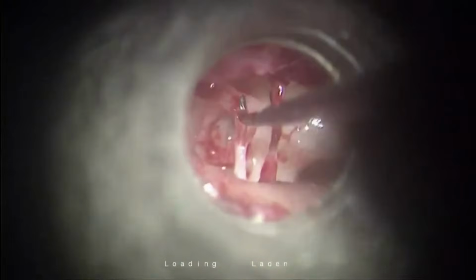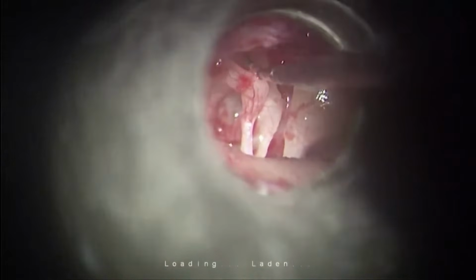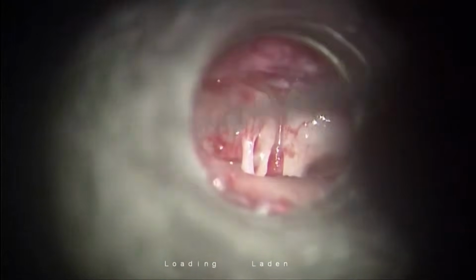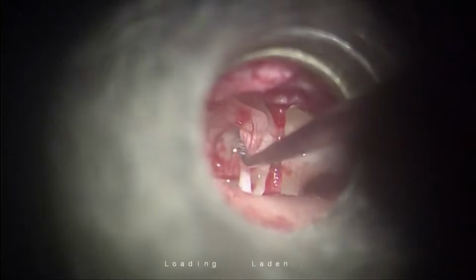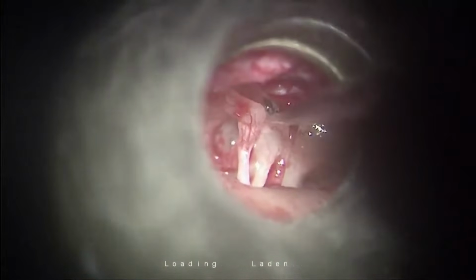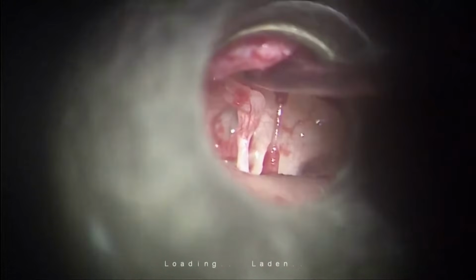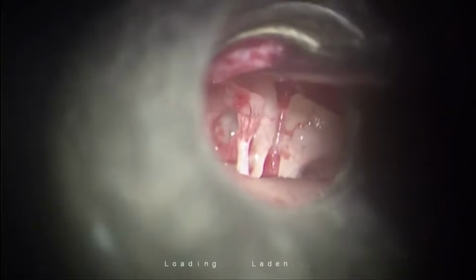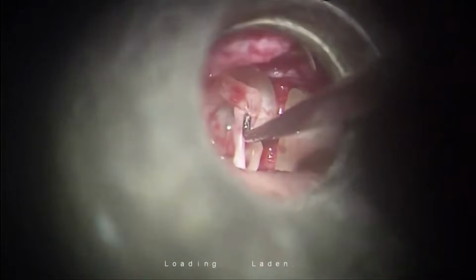And you have seen the last case, the reverse stapedotomy. Here, sir, I am going to use the CO2 laser. In the last case, you had seen the KTP for the particular purpose of handling the vessels. Here I am going to use the CO2 for the rest of the steps, and see the level of the joint first. You saw Ashish opening the joint in the last case.